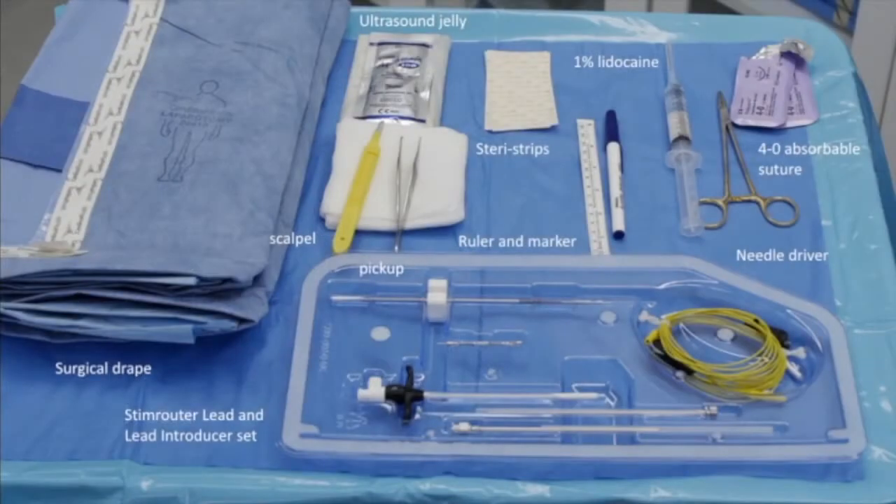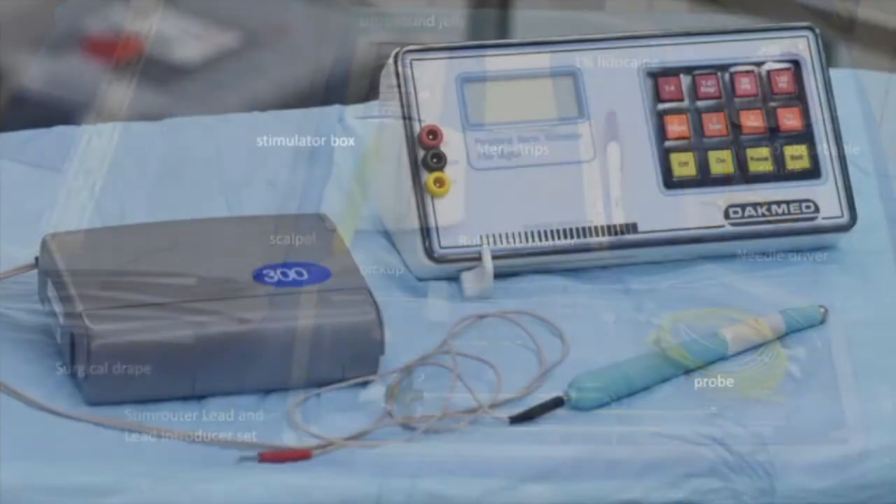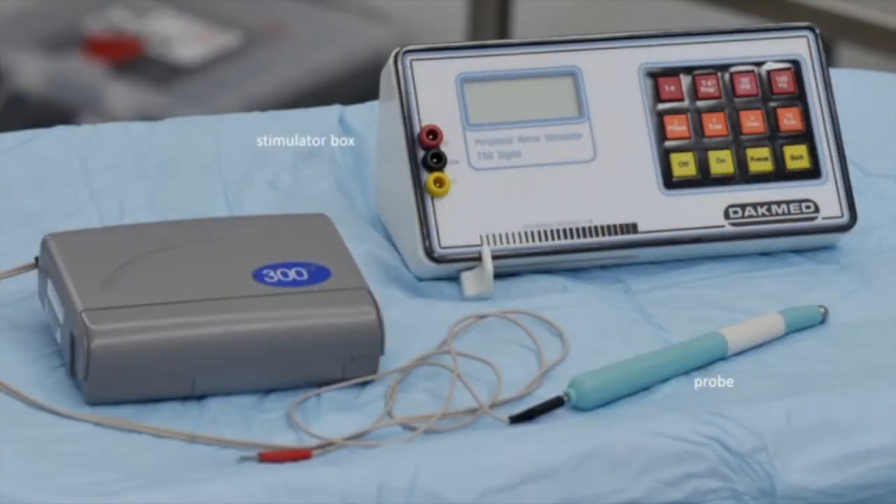Necessary instruments for the procedure are displayed here. Here is a typical stimulator box used in neurosensory testing during the procedure.